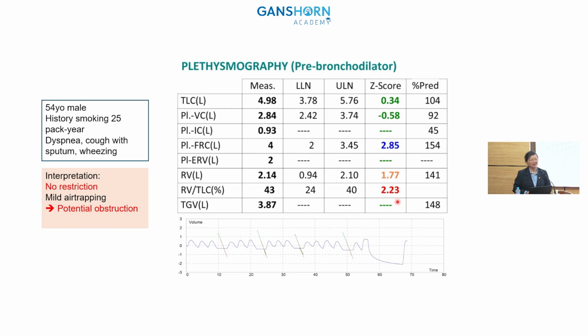But in Vietnam, because of the lack of equipment or because of the cost, I think that most pulmonologists just stop at the spirometric test. And you have seen that it is not enough. The box is paid by the insurance, so please do use it.